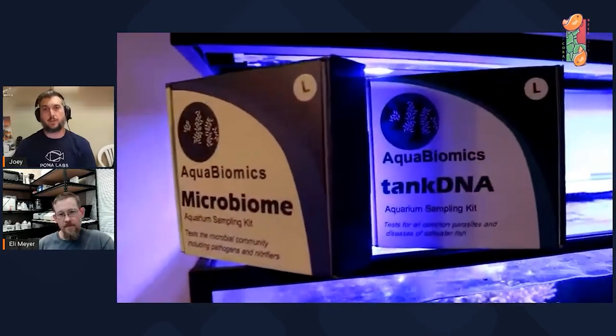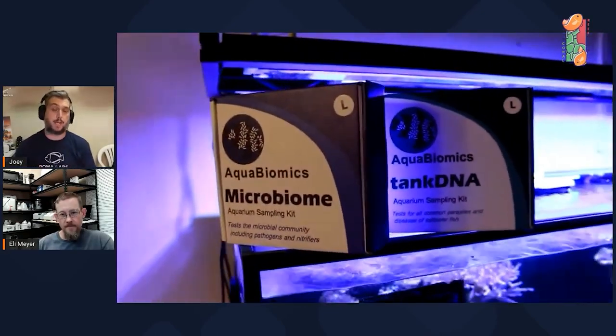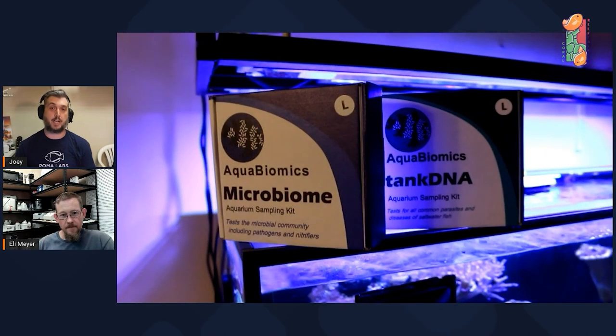With these tests, you're able to see into the world of nitrifying bacteria and beyond. We as hobbyists know about the nitrogen cycle — ammonia converts to nitrite to nitrate — and you can actually see the bacteria responsible for that. That's a great example of the good bacteria we're hoping to find. One reason to use these tests is to find out: do I have the microbes I want for a successful reef ecosystem? The flip side is identifying bad bacteria — pathogens causing diseases for fish or corals.